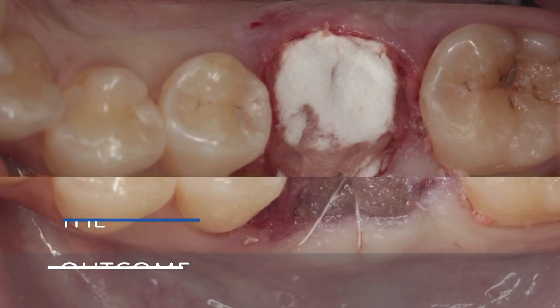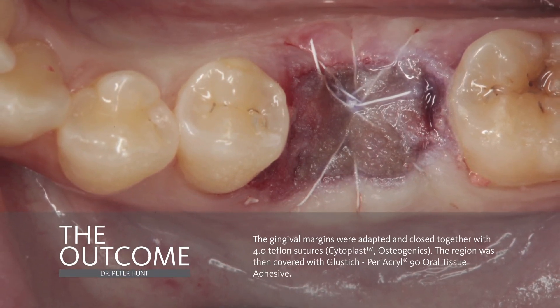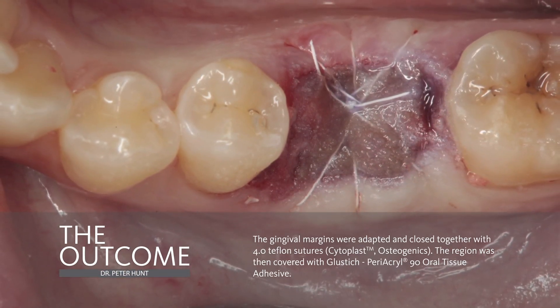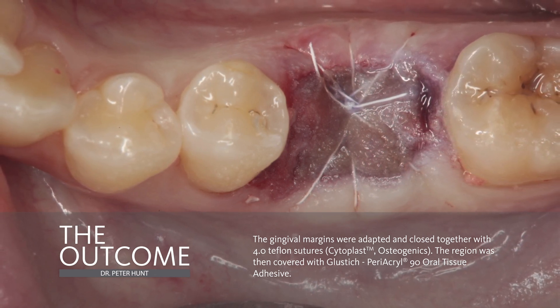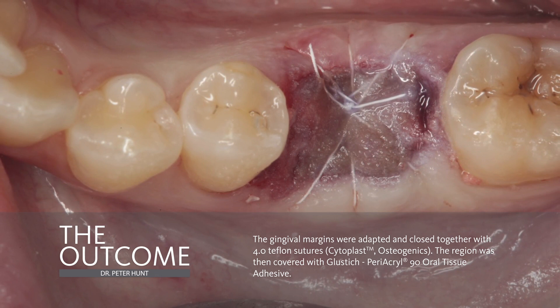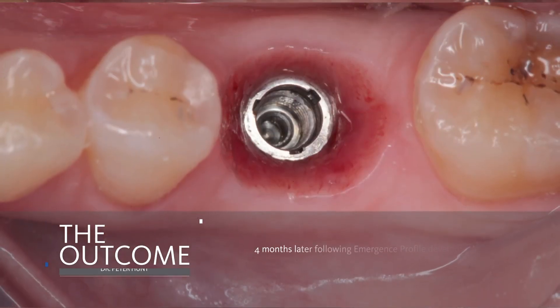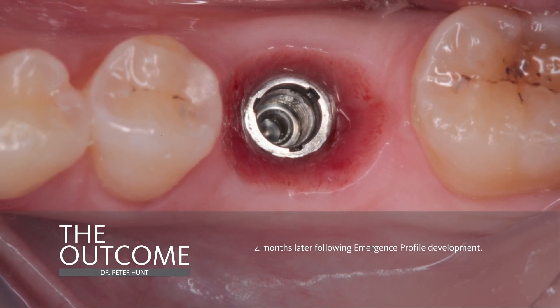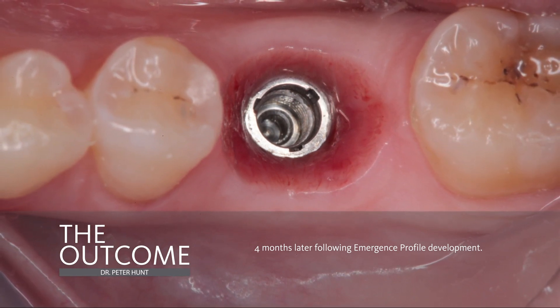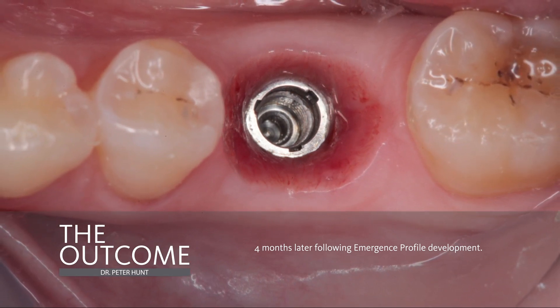At this time, you can see that I've sutured across the top of the mucograft membrane. And it's all one time, so it pulls tight. I am not trying to advance the flaps over the whole socket, just to hold the whole thing together. And here you see the emergence profile that we've been able to develop. And you can see that we have great emergence form, and we have been able to reproduce the anatomy of a tooth coming up out of the soft tissue complex.